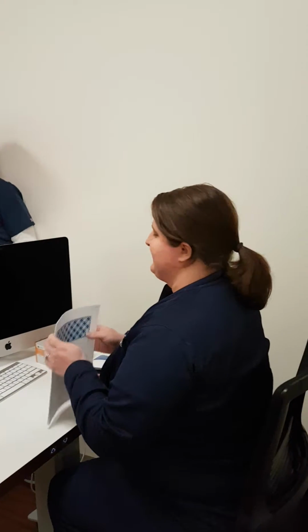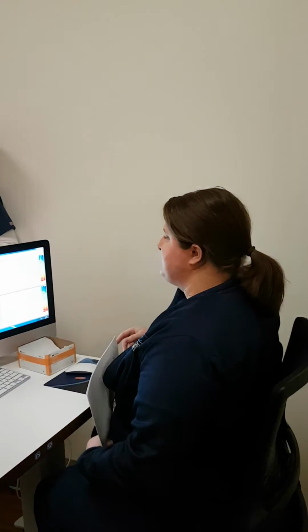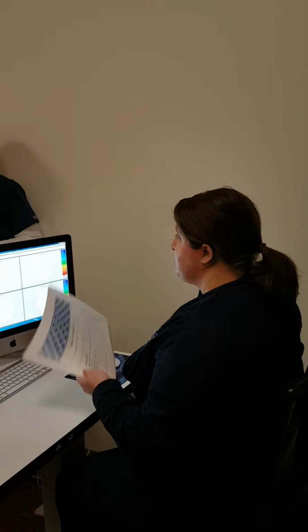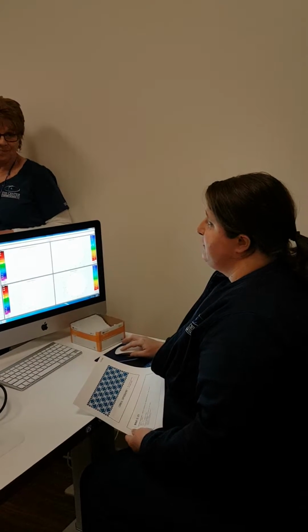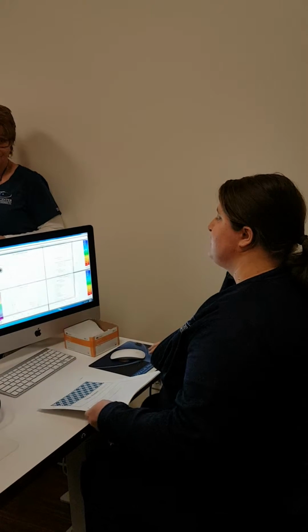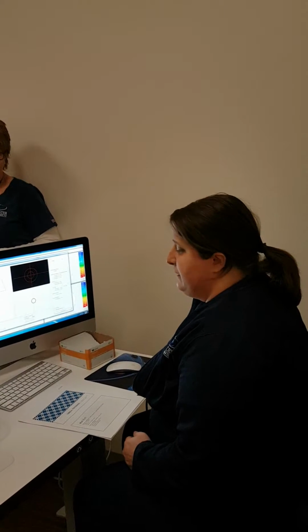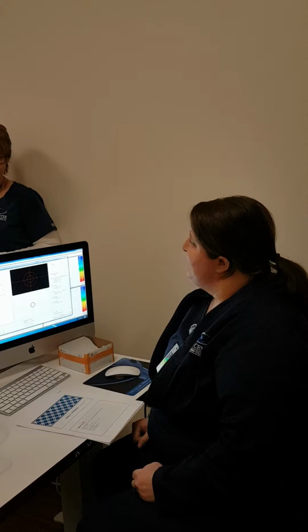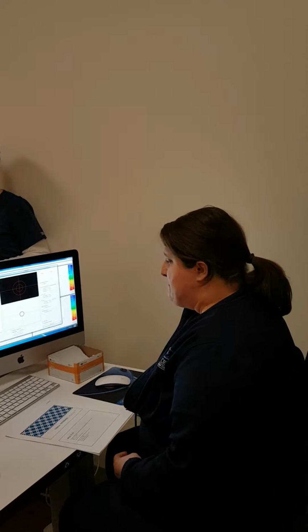I was worried I wasn't going to have enough time to do that and the practical stuff. So if you guys want to practice on each other, practice together, I am totally fine with doing that. I can give you a few tips and tricks with regard to how to take the image a little quicker, at least what works for me. But it is just practice that really helps, okay?